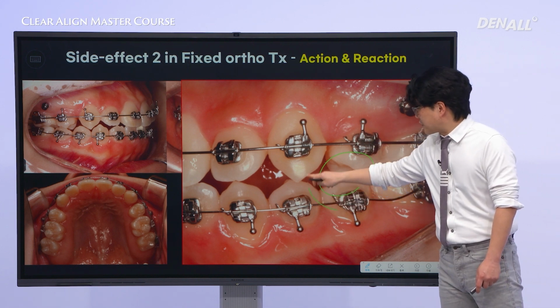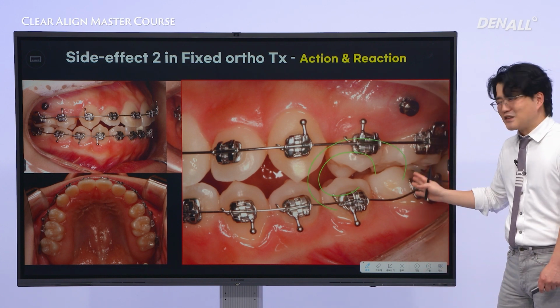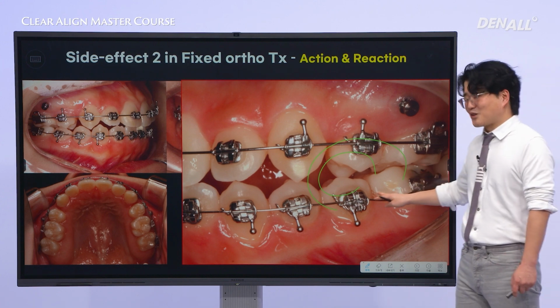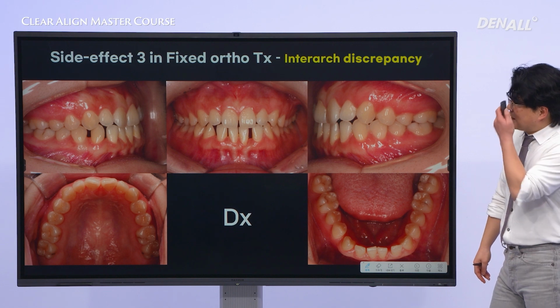So we ended up with this buccal overjet. In the end, it was my mistake. Fixing this would take additional time. Let's take a look at the third mistake.